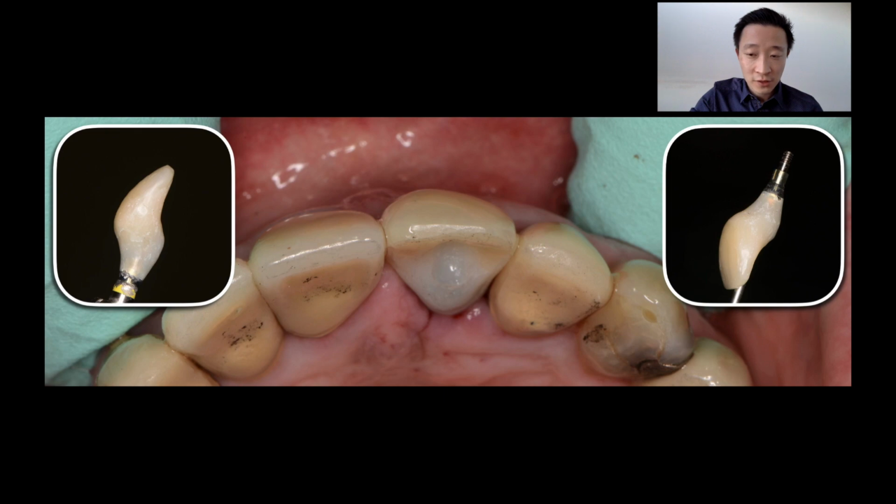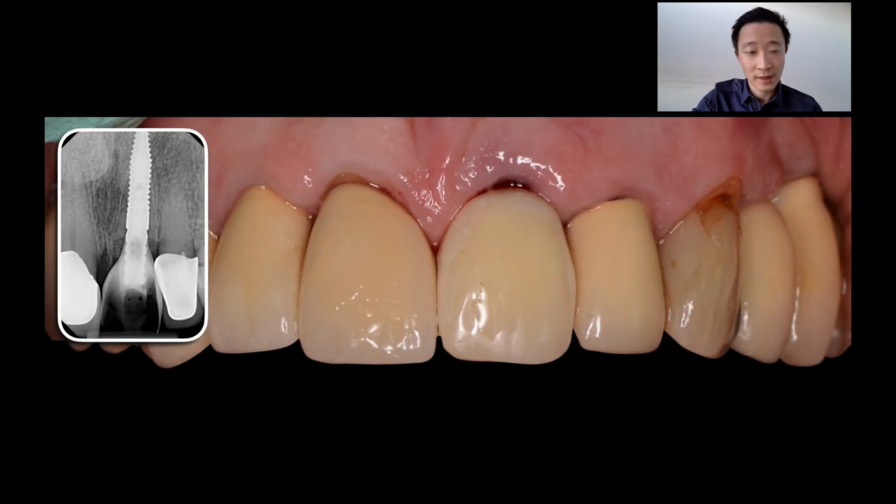I used a provisional here. I made a provisional, but really in hindsight, I should have used his tooth that we had taken off. But either way, the provisional was placed here, screw retained, as you can see. And that's the final PA on the day of surgery, as well as the way that he leaves the clinic.